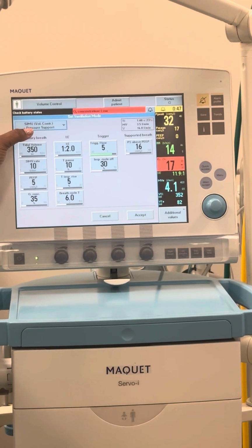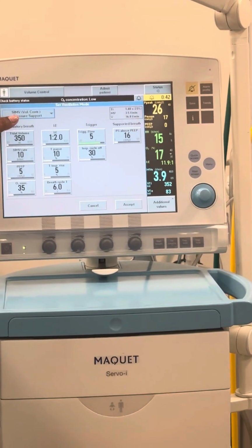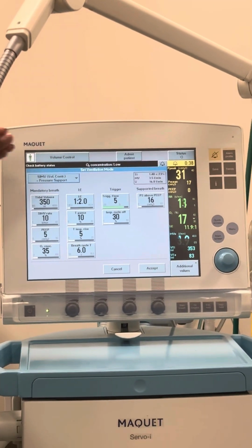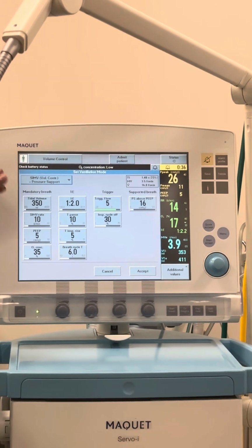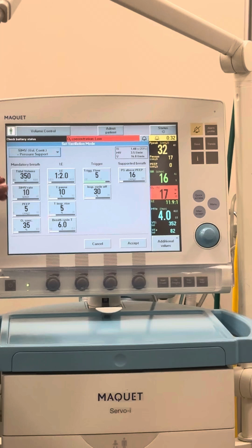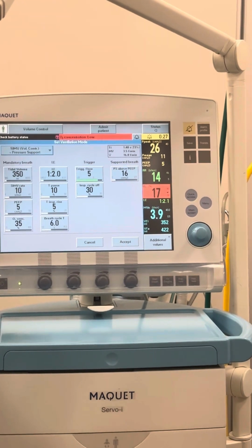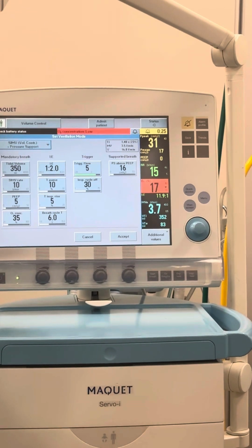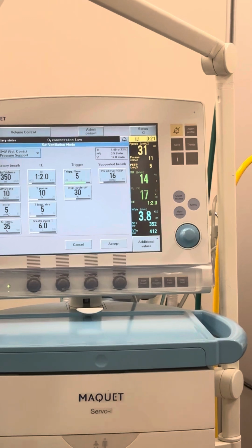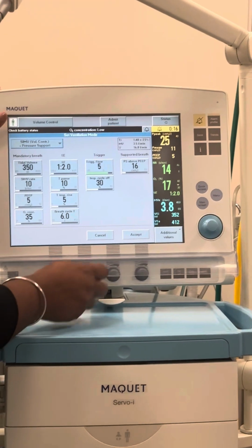All right, choose the right one, because if y'all come to oral finals and don't pay attention, not reading the modes, it can really trick you up because there are 3 different SIMVs on this one. So choose the right one. If not, your whole entire check off on SIMV weaning, the whole thing is going to be wrong, and we will mark it wrong. Please read. This one actually does not highlight yellow, it does not tell you what you basically need.